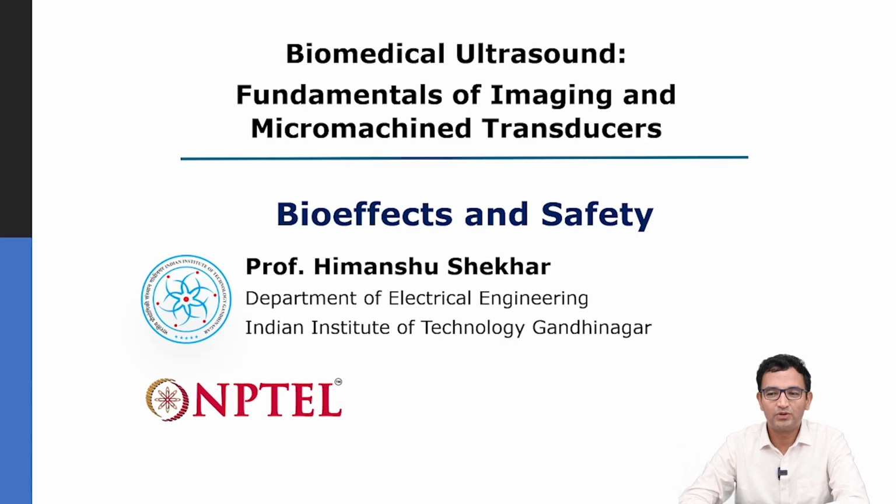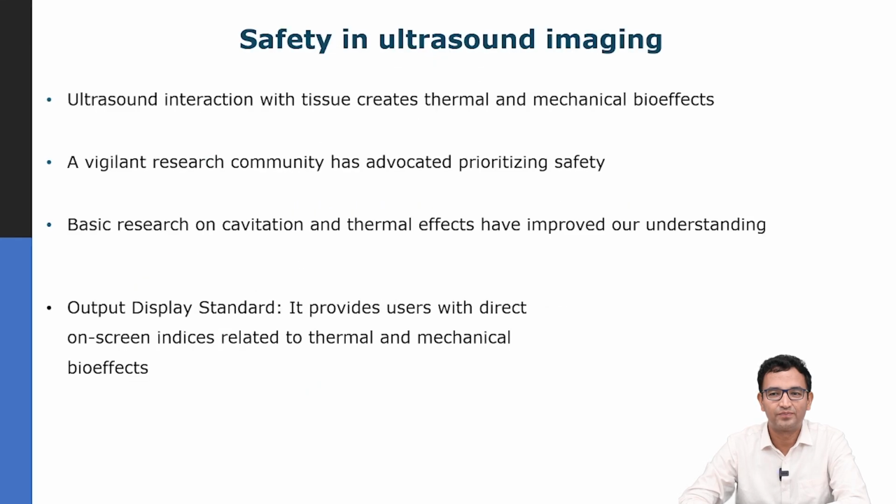Hello and welcome to the lecture on bioeffects and safety. In the last lecture, we discussed safety in ultrasound imaging. We discussed how ultrasound interacts with tissues, creating thermal and mechanical bioeffects.